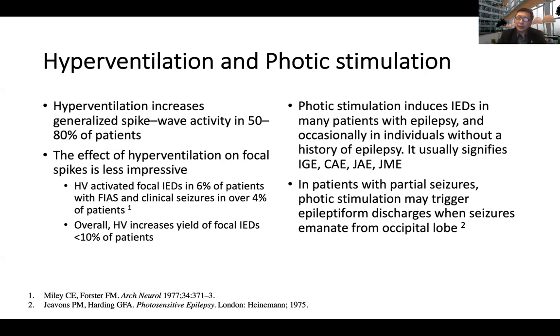How about photic stimulation? It induces IED in many patients with epilepsy, and occasionally in individuals without a history of epilepsy. It usually signifies particularly IGE, childhood absence, juvenile absence epilepsy, or even JME, juvenile myoclonic epilepsy. In patients with a partial seizure, photic stimulation may trigger epileptiform discharge when the seizure emanates from the occipital lobe.